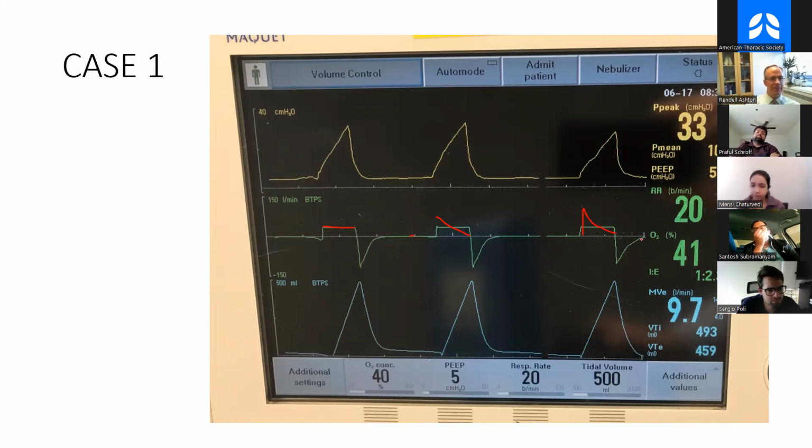Does that help? Now, it doesn't always get to zero because usually inspiration's too short for those pressures to equalize. So a lot of times, if you've got a pressure control inspiratory pattern, this will go up to a peak inspiratory flow and then it will come down and it will end up somewhere above zero flow at the end of the breath.